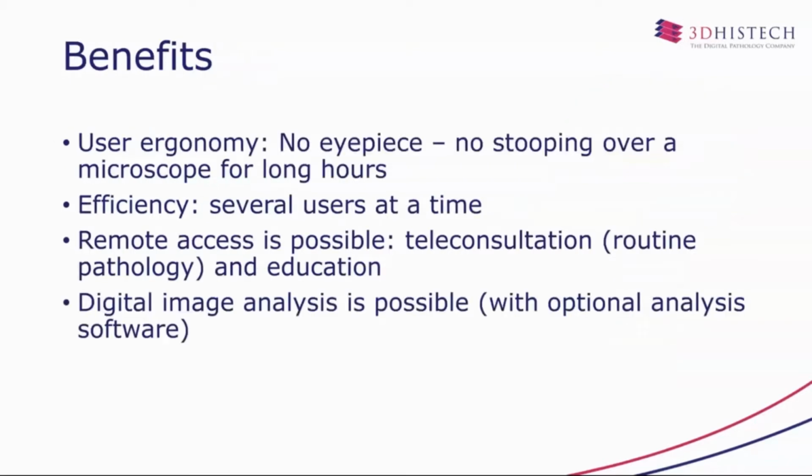Okay, so what's a slide viewing solution? Well, it's very easy. It's software for opening and viewing digital slides. These solutions are called a number of names. Leica calls them pathology slide viewing software. Hamamatsu calls them viewer software. Somebody calls them digital microscopy software or a digital microscope application, but whatever you call it, it's indispensable in digital pathology. As soon as you have a digital slide, you will need a viewer to open it and to handle it. So what are the benefits of these digital slide viewing solutions?